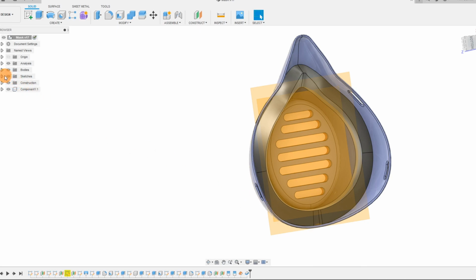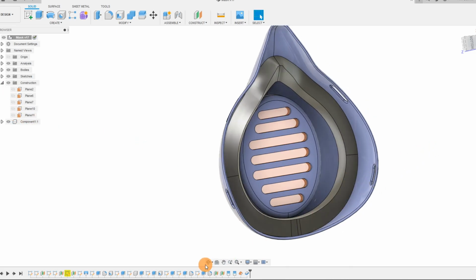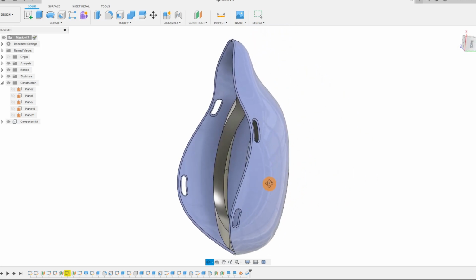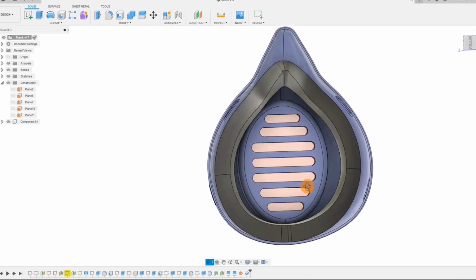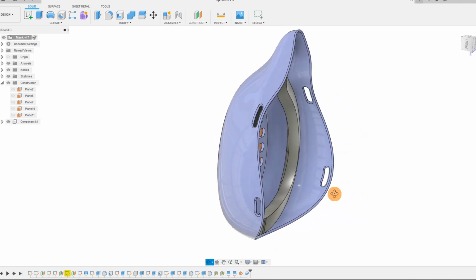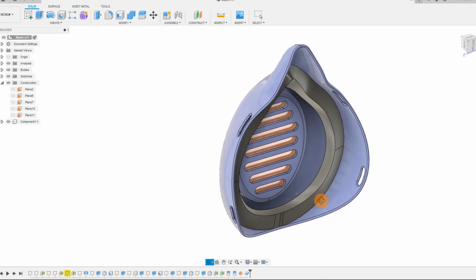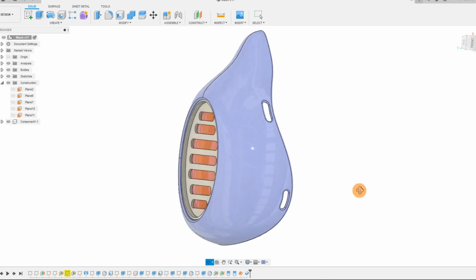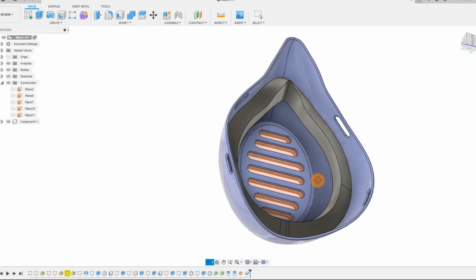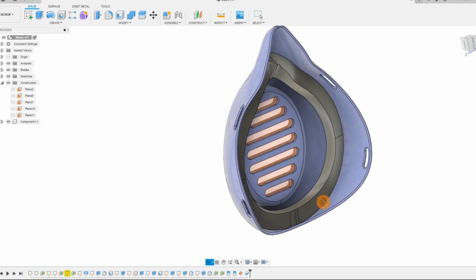And what we can do, if we so choose to, is we can come to construction and we can just hide our surfaces here. And I can just orbit this. We can look inside and see the change that we've made with this foam gasket. And that's how we create our foam gasket piece.